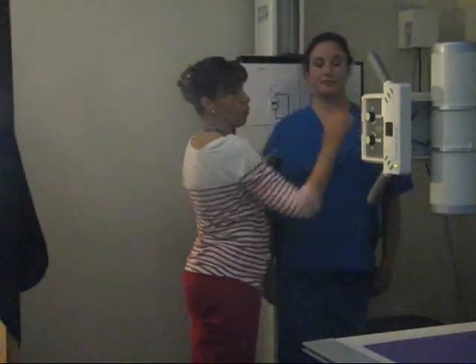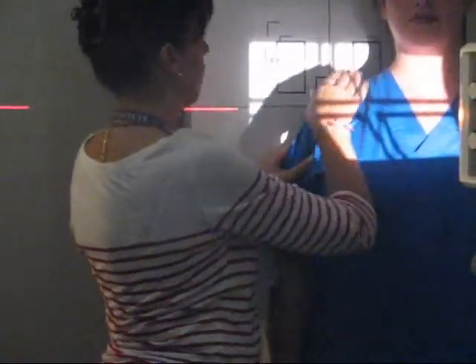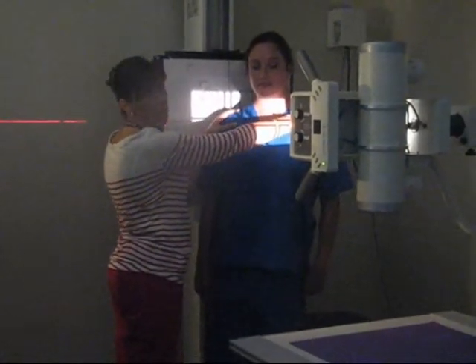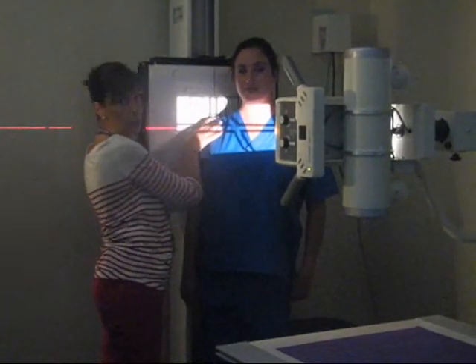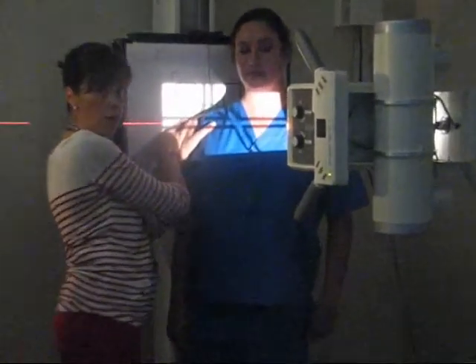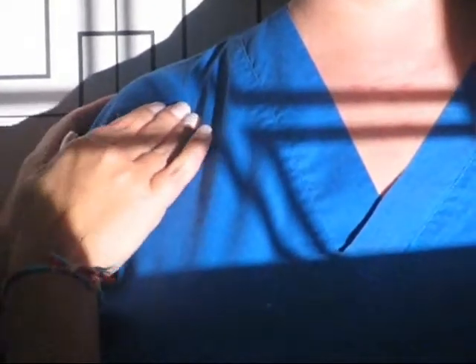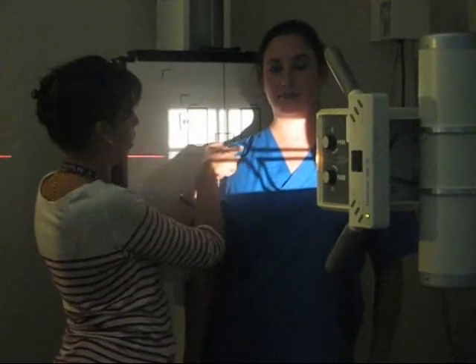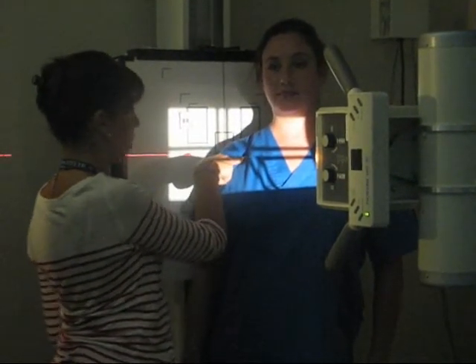And basically, you're going to do the exact same thing as you did for the AP of the shoulder, but you're going to turn the patient about 35 to 45 degrees with the affected shoulder closest to the IR, okay? You're going to try the central ray to be directly on that space, as I mentioned previously, where the head of the humerus starts its connection with the shoulder girdle. So right there is where you're going to want your CR, okay?